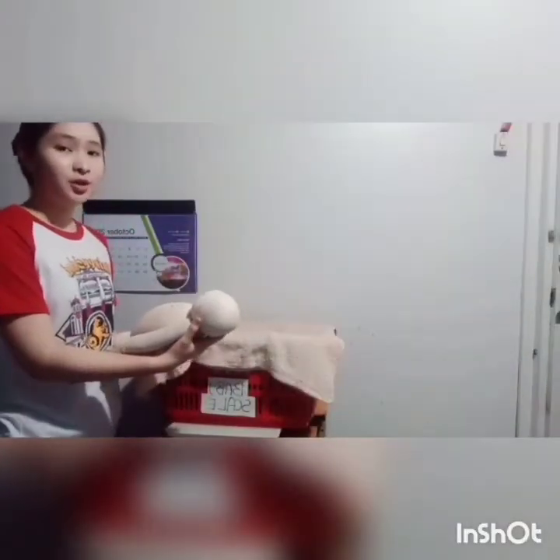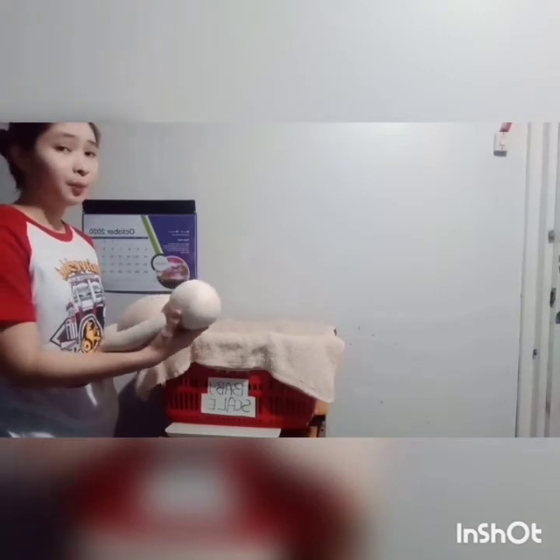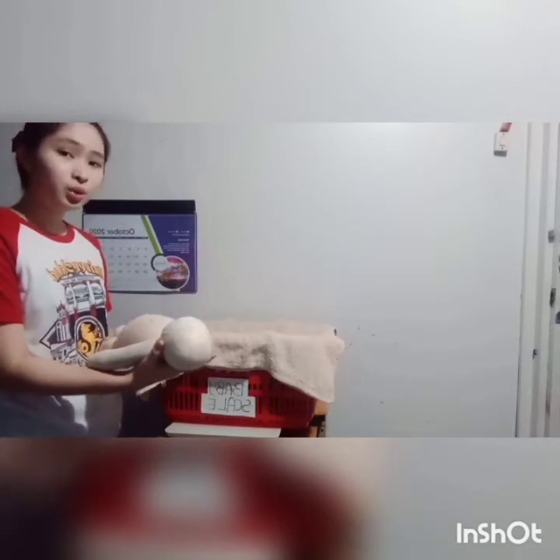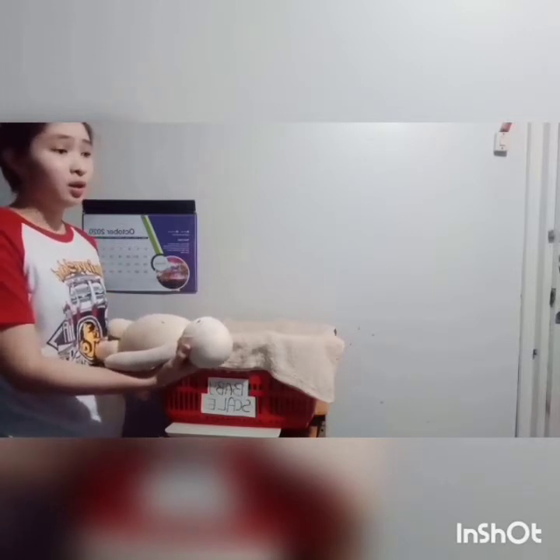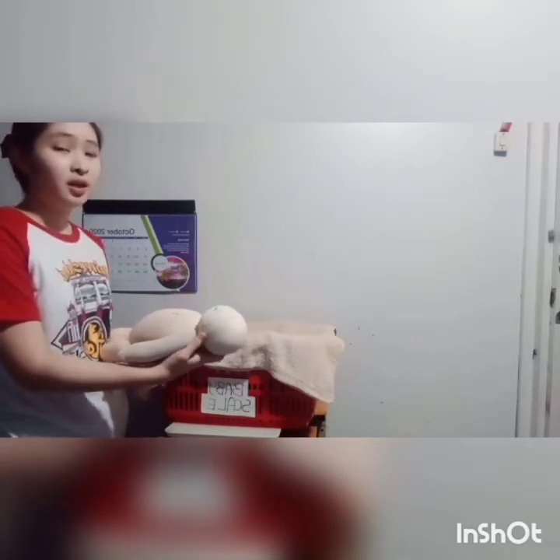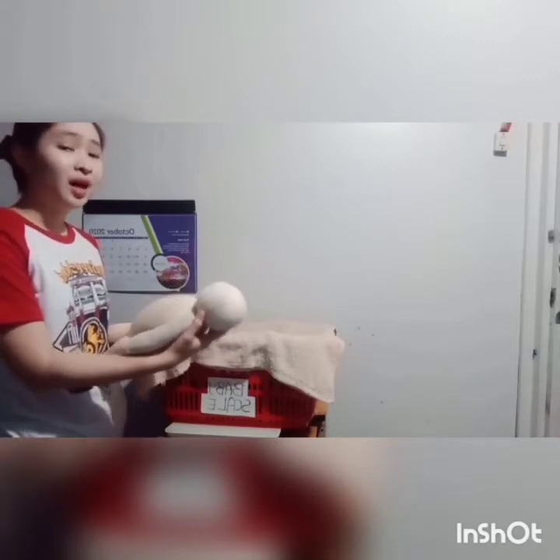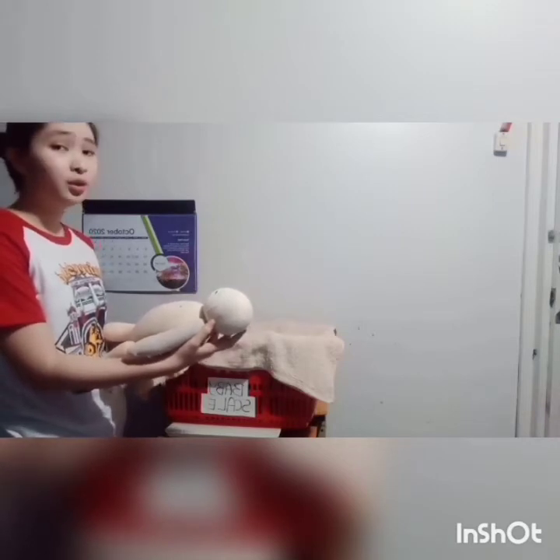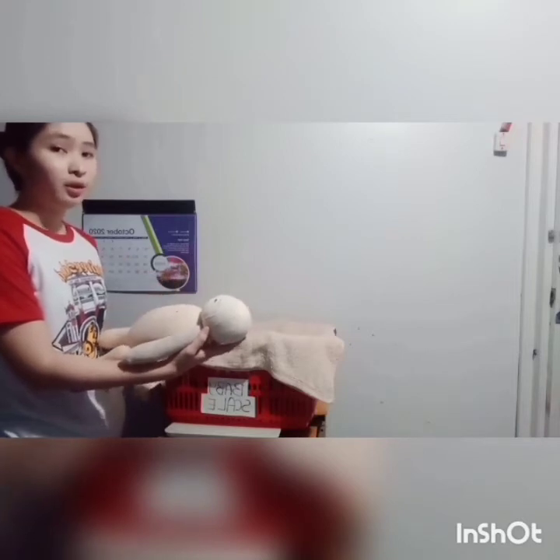Now we're going to measure the weight of baby Emmy. Before we proceed on weighing the baby, there are things that we need to take into consideration, because sometimes there are cultures that prohibit the baby to be entirely naked. So in measuring the baby's weight, we need to take off all the clothes of the baby if it's possible. But if not, we can perform the weighing with the baby having her clothes on. But we need to subtract the weight of the baby's clothes from the final weight of the baby.